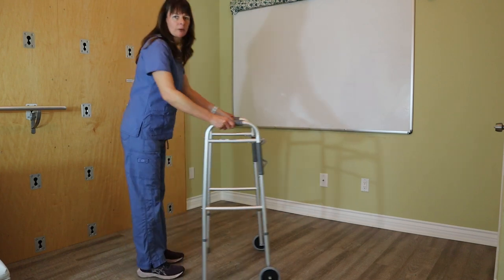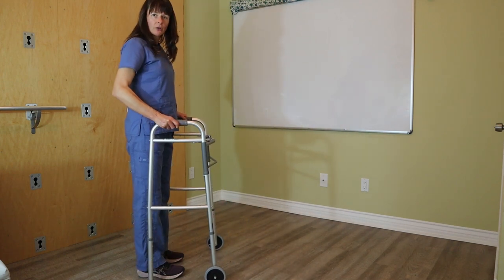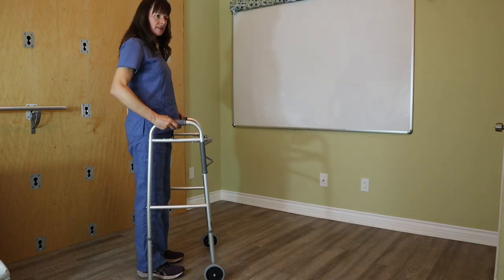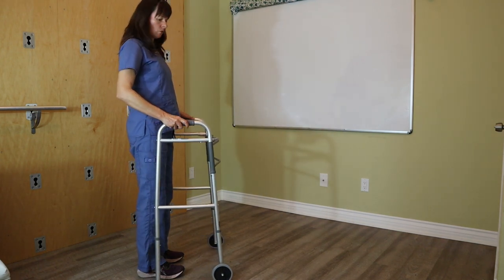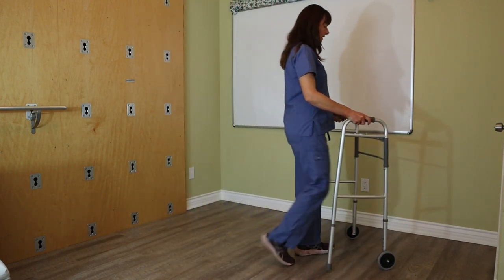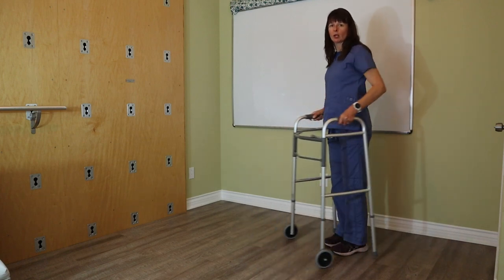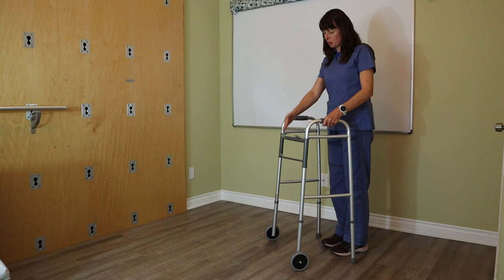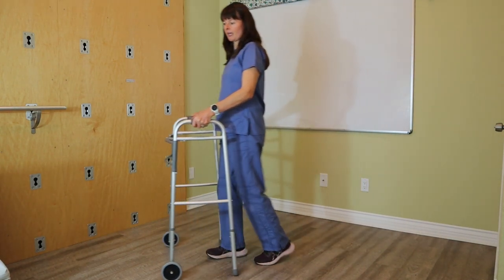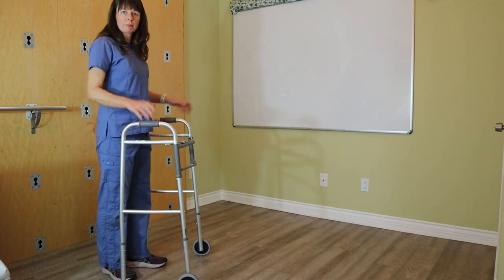Rather than the patient putting the walker out front and bending at the hips, which would really set them off balance. This particular walker has wheels on the front legs, so I can just slide it on the floor as I walk forward — very steady. My arms are not moving any closer or further; the distance from the patient to the top of the walker stays the same, giving the patient additional stability they might be lacking.